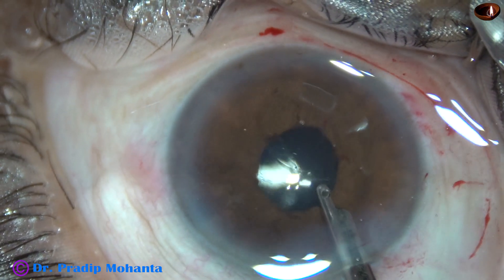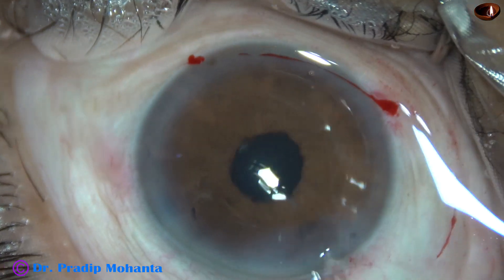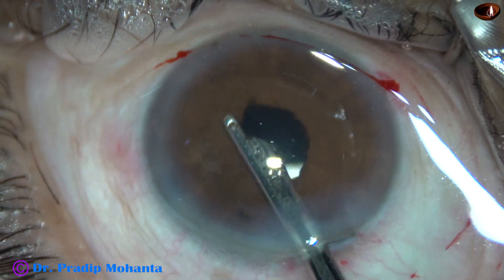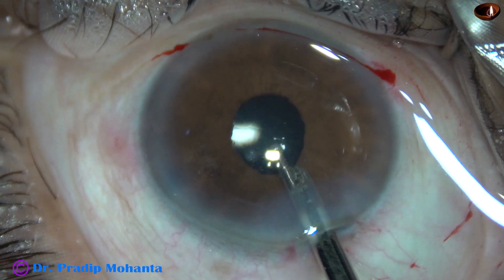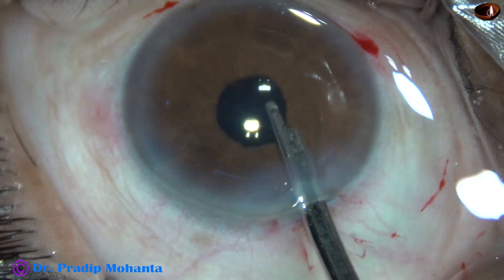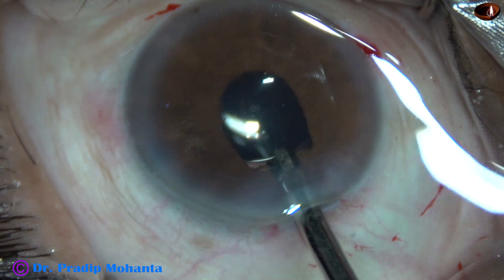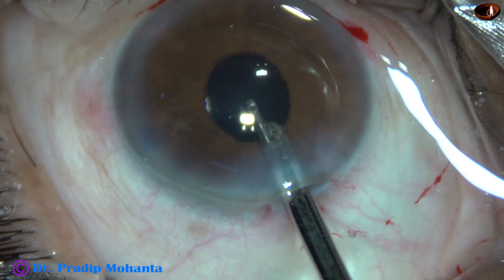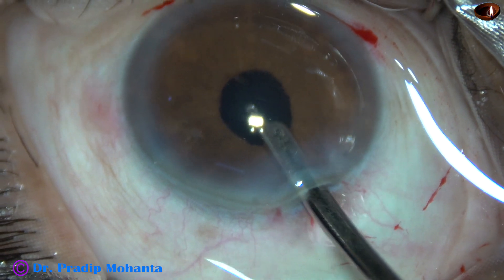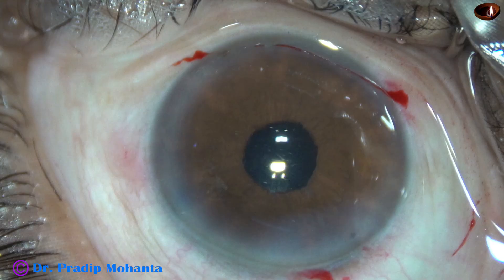The surgery is nicely done, but we still need to dedicate quality time to removal of viscoelastic. Viscoelastic from the anterior chamber is removed nicely. I then go behind the IOL and remove the viscoelastic from the capsular bag — this is very important. Although the pupil size is small, we must go behind the IOL and remove the retained viscoelastic, otherwise there will be high intraocular pressure the next day.